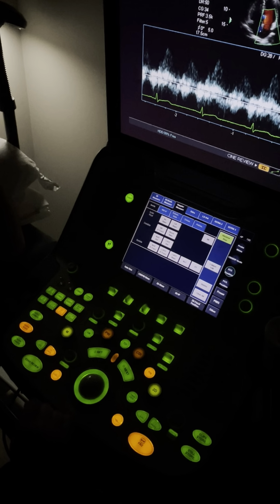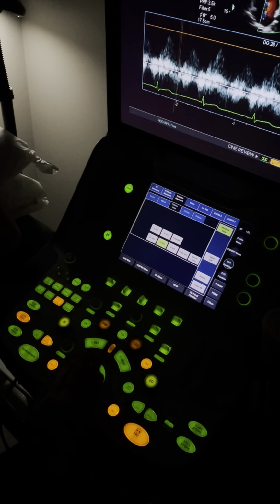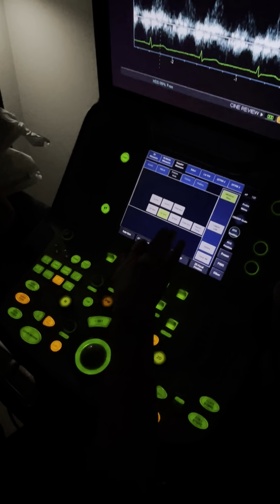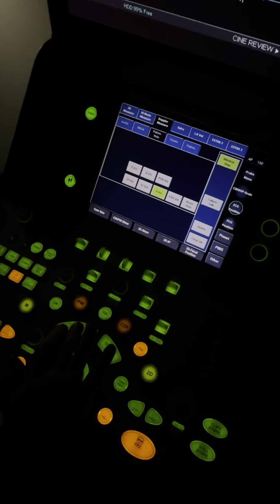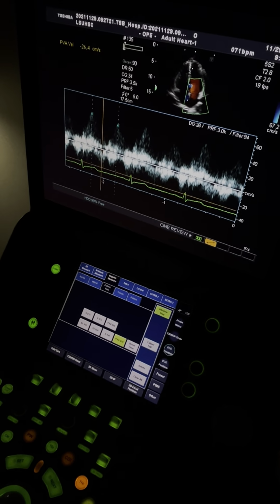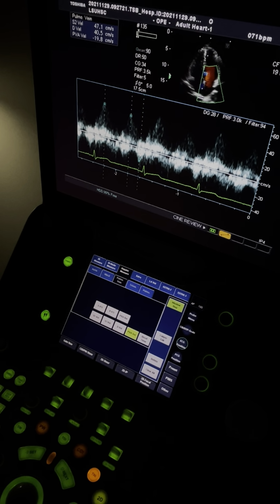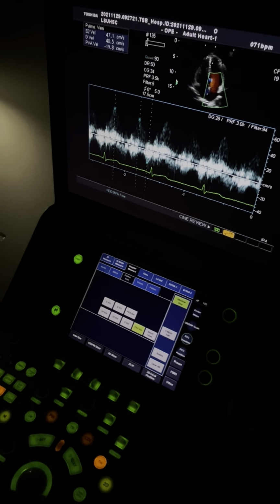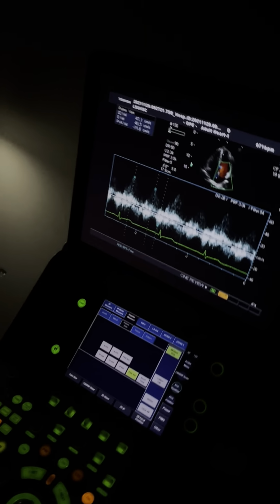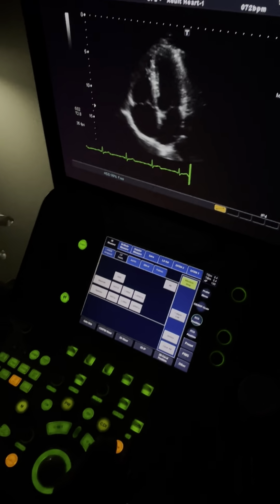Sometimes you have to be patient. Pulmonary vein, I'm going to use S2 on this machine. D. A velocity, and Val's got the same problem Kyle had, but it's probably right there. Okay. Remember, if you need an AR velocity, it'll be there. Trust me. Now we're going to go to tissue Doppler.